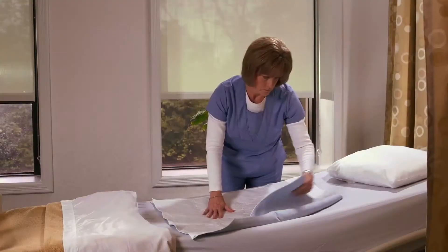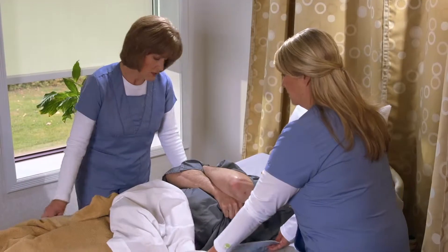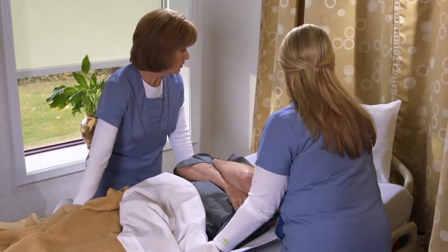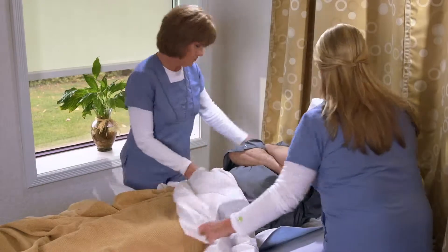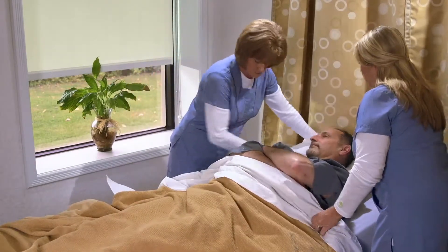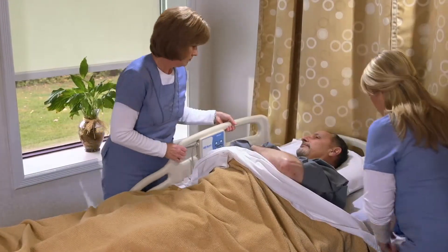Underpad. The underpad is multifunctional. In addition to being effective in handling incontinence, it also allows for easier movement for the patient and the staff's ability to move them. The underpad is designed for incontinence — it is absorbent, and the white quilted fabric on top ensures that Dermatherapy stays closest to the patient's skin.